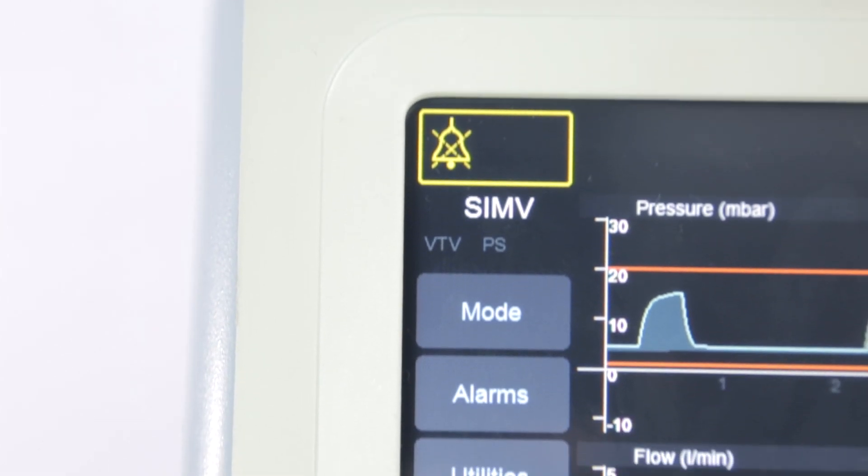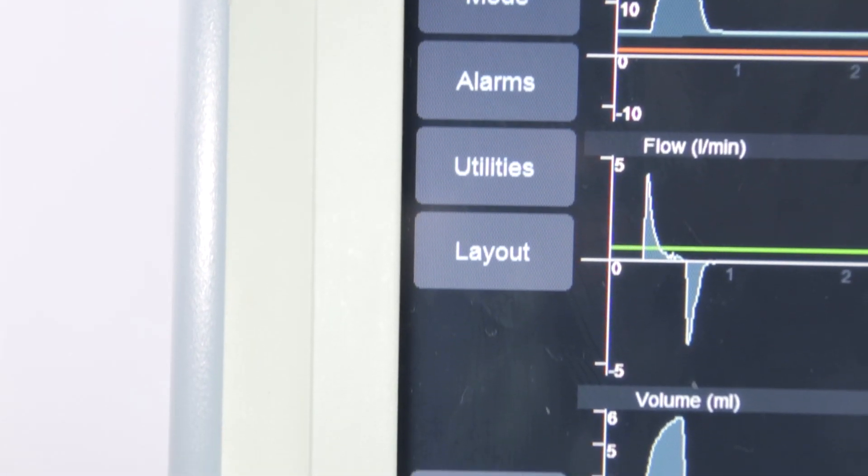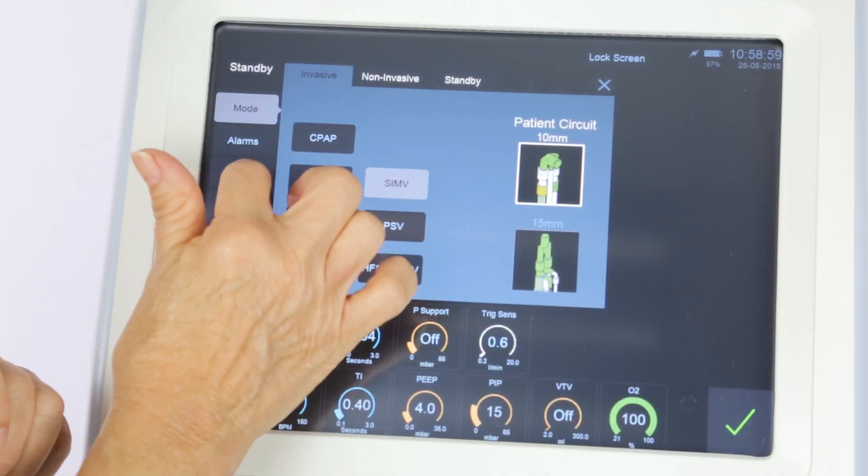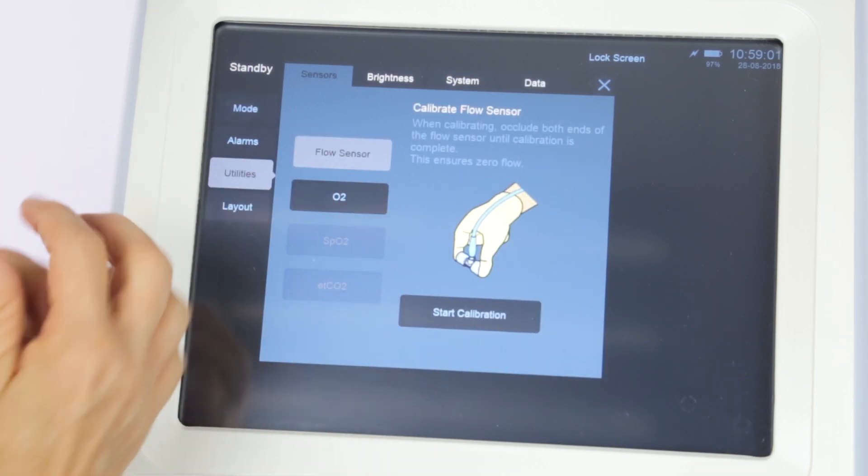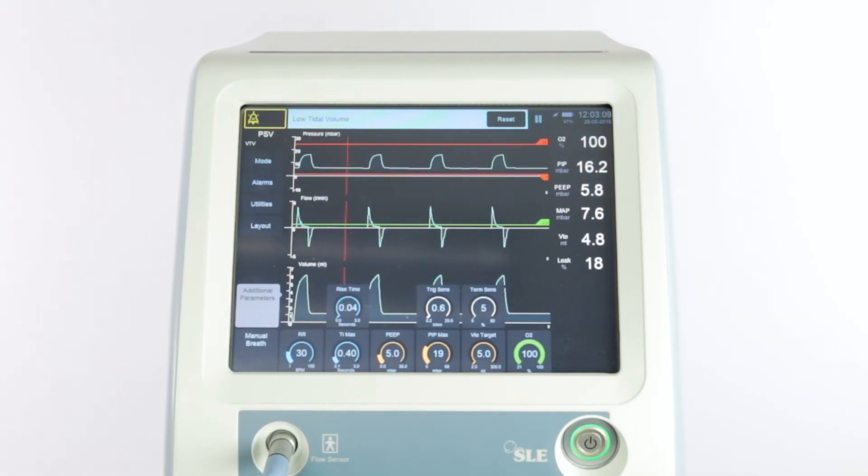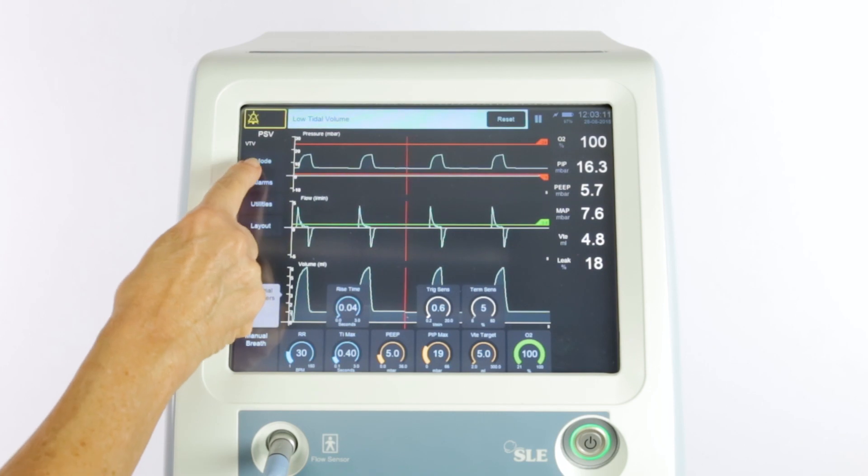Moving to the main controls, there are Mode, Alarms, Utilities and Layout, which give access to most of the main ventilator settings. The first Mode button allows the user to switch between any of the modes on the ventilator.